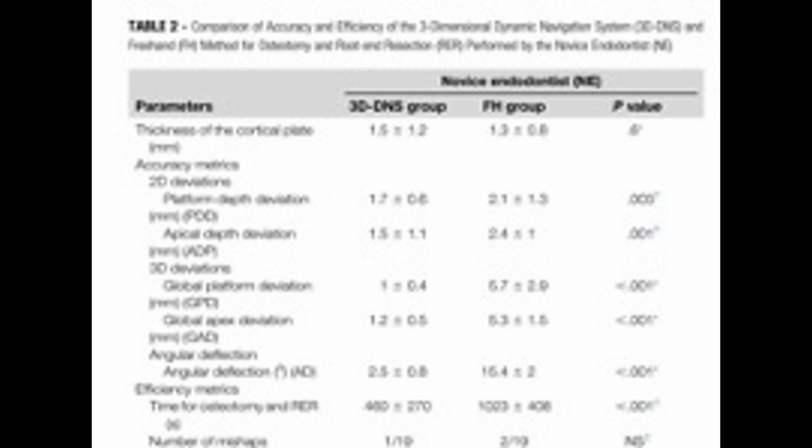Also, virtual planning is a critical step in 3D Dynamic Navigation System, and it requires a person who has a good background and anatomy knowledge to plan for the surgery.